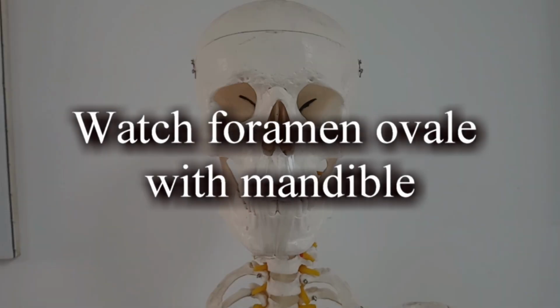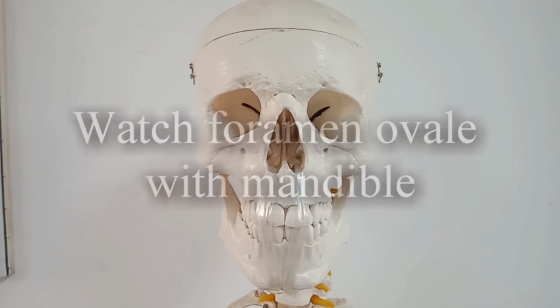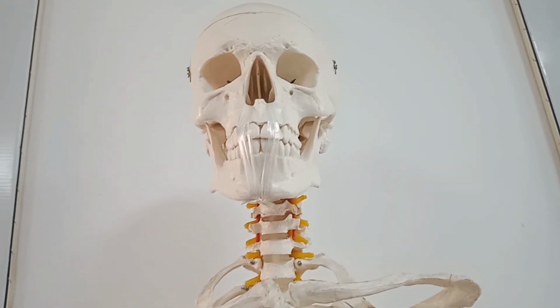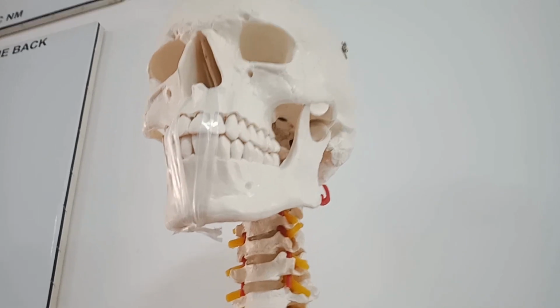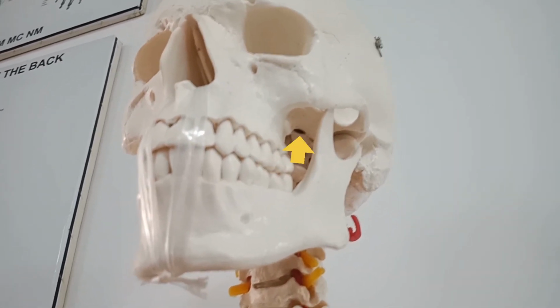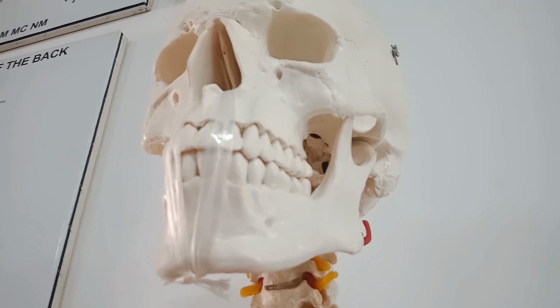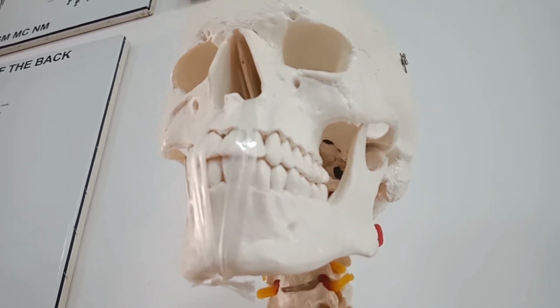In the same way, if you see the whole skull with mandible, this is the AP view. Now coming submental, and see the foramen ovale in between the mandible and maxilla. That is the only gap through the buccal mucosa. You can see the foramen ovale and enter through the foramen ovale.